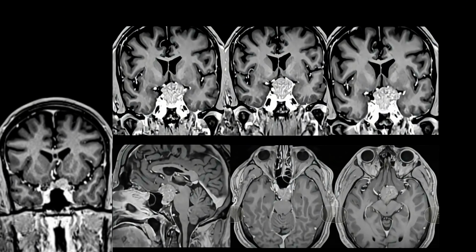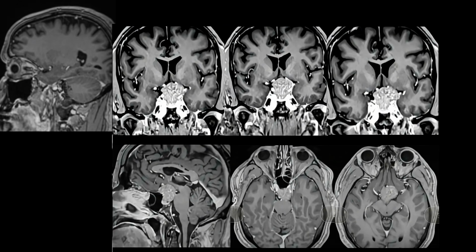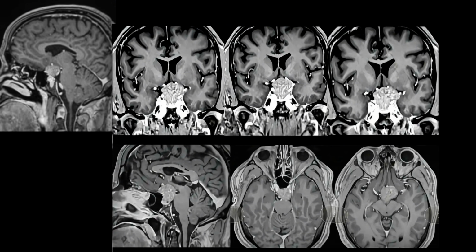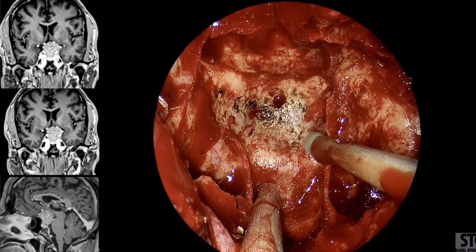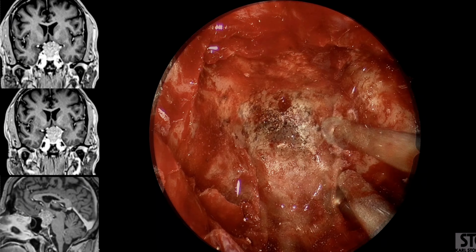MRI demonstrated an extra-axial contrast-enhancing mass in the suprasellar region consistent with a tuberculum sellae meningioma. The lesion caused superior displacement of the anterior cerebral arteries and involvement of the left supraclinoid internal carotid artery, extending towards the inferolateral aspect of the left cavernous sinus. Both optic nerves and optic canals were involved, more prominently on the left side.